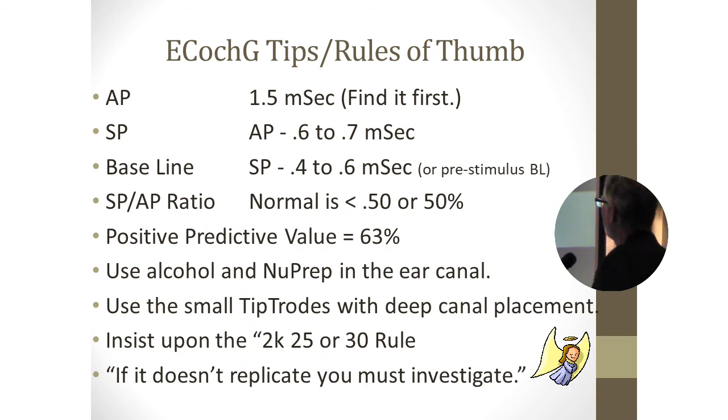A couple of other things to know: you've got to use prep in the ear canal. Now, you're not just doing skin prep, you're actually doing ear canal prep. We just use a Q-tip with a little dab of Nuprep on it, so we're degreasing and abrading the ear canal, and we're doing very deep canal placement. That's necessary. Make sure you insist on at least a 2K25 rule. No threshold at 2K worse than 25 dB if I'm to expect to be able to do this test.